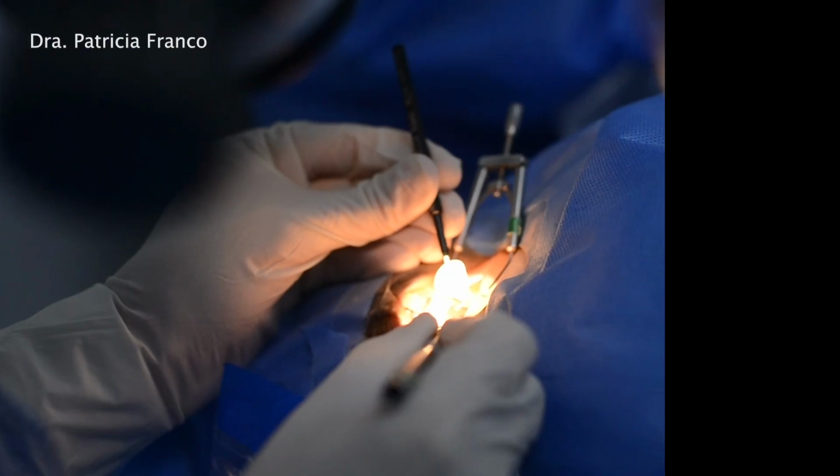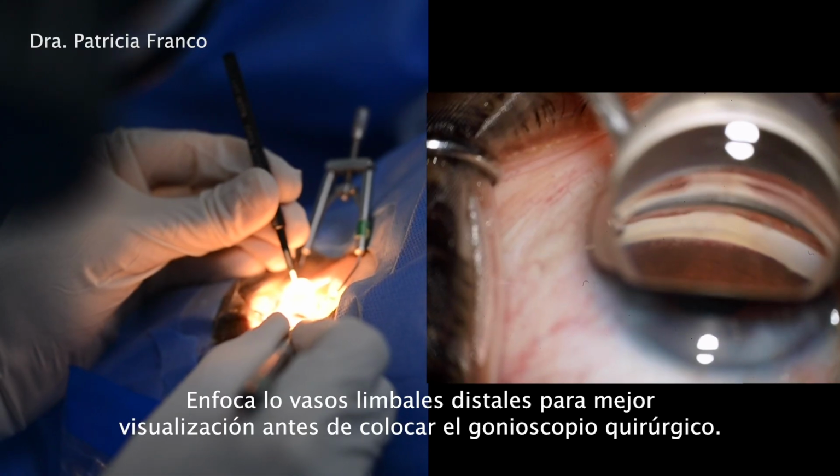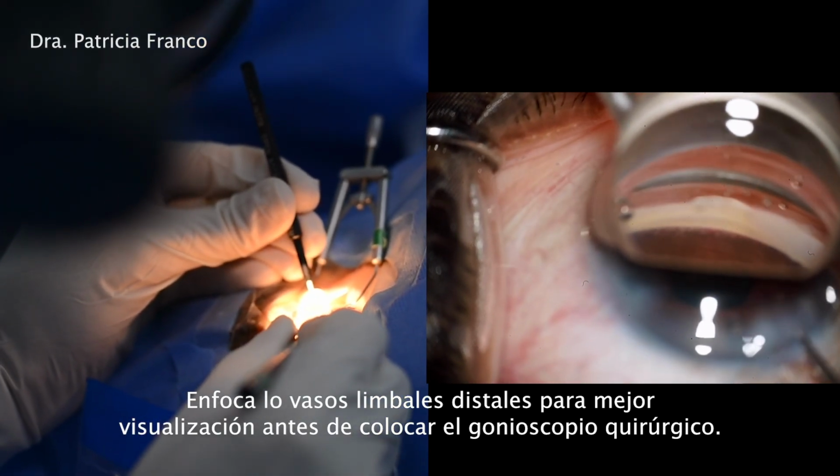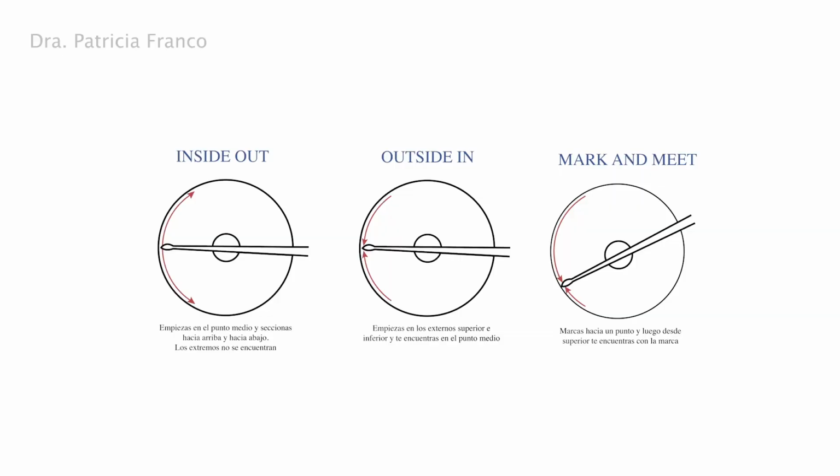I am now placing the gonio lens for angle visualization. You can focus on the distal limbus so that when you place the lens, visualization is better. There are three basic techniques to excise the trabecular meshwork.